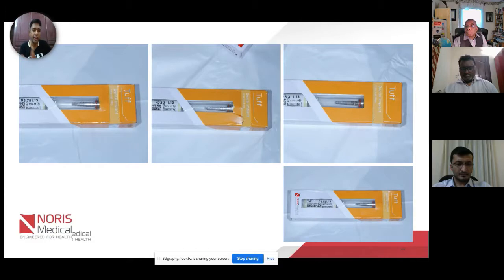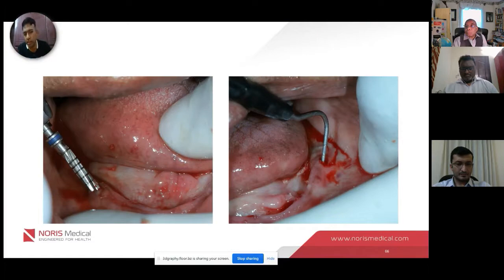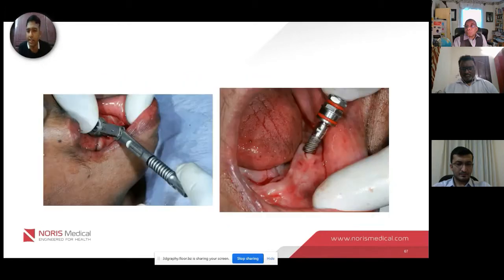I go for some more drilling again. So the implants in position, I check. This is something I use for getting a tactile feel that my bone is good. Of course, you can take check x-rays, but I have not taken any check x-rays because I'm so confident of my team in CETAS. So implants placed with very good stability, and that is all.